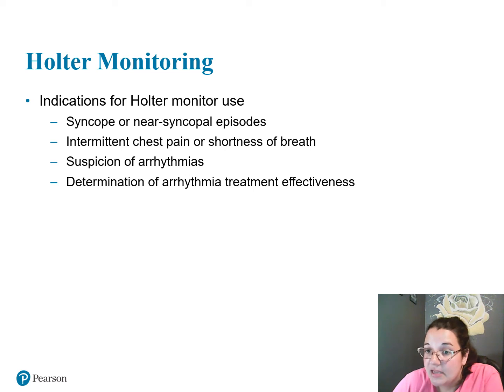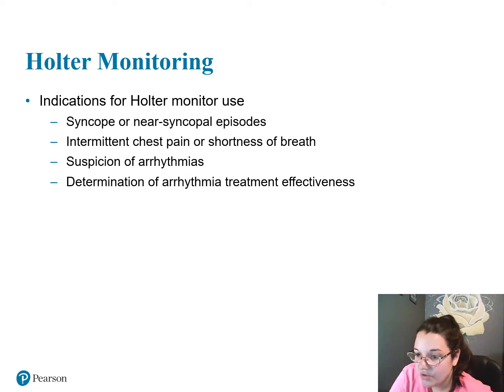Intermittent chest pain or shortness of breath, suspicion of an arrhythmia, and determination of arrhythmia treatment effectiveness. So again, Holter monitors are ambulatory, and this could be for patients who have had routine EKGs, who have the symptoms, but the EKG does not show that they're having these symptoms. So we might send them home with one of these monitors and monitor them over 24 hours.